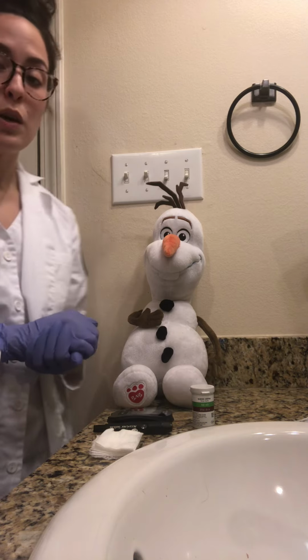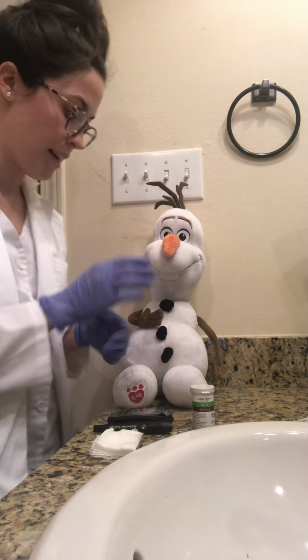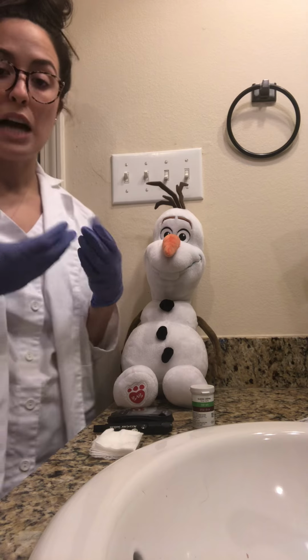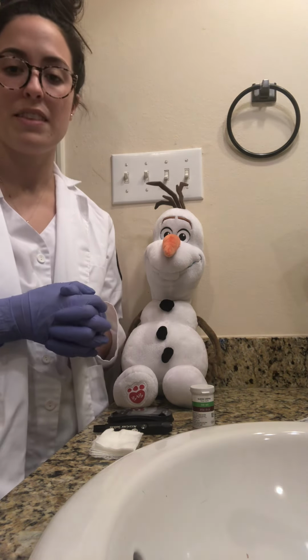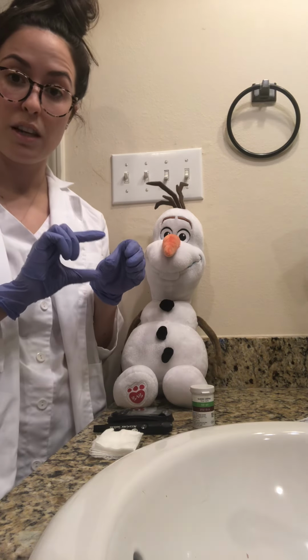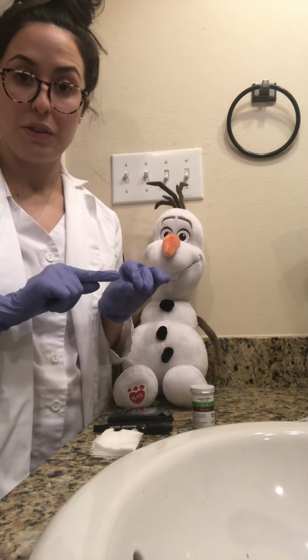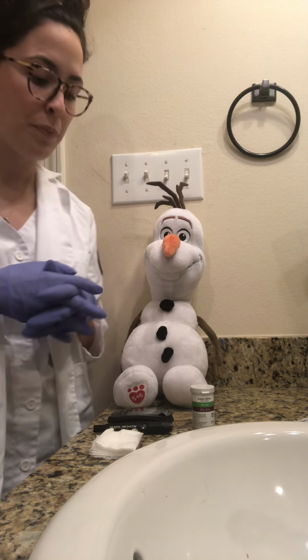Okay, great. So there are numerous sites that you could take for injecting insulin. A lot of people do it on the back of the arms. You could also do it in the abdomen as well as the thigh. And depending on how much adipose or subcutaneous tissue they have beneath the skin, if you can pinch it and it has 2 inches of wiggle room, you can inject at a 90-degree angle. If it has just about 1 inch, you could do a 45-degree angle, just to make sure that you get it in the right type of tissue.